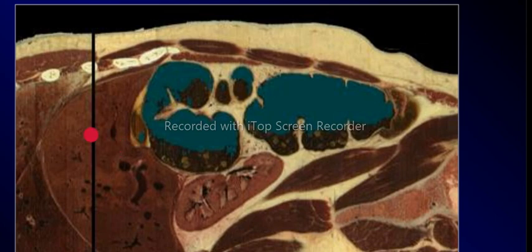And then here you have your liver. This is the dome of the diaphragm. So this is thoracic cavity above, and below this is your abdominal cavity. Then this is your ascending colon, and then this is small bowel, and fat in between is mesenteric fat. These are muscles of the anterior abdominal wall, rectus abdominis, transversus, etc. And then you have here the subcutaneous fat and skin on this side and this side.